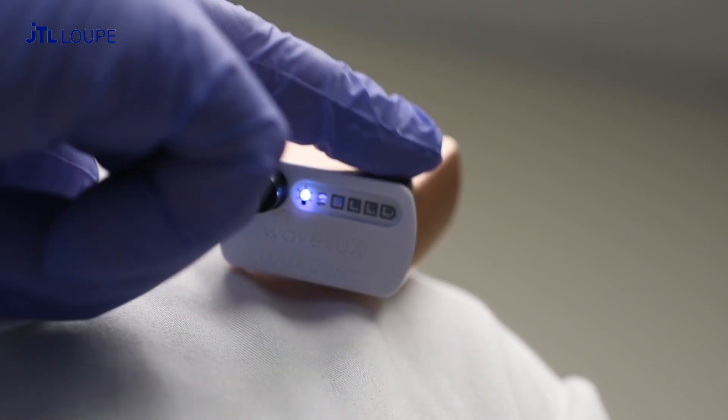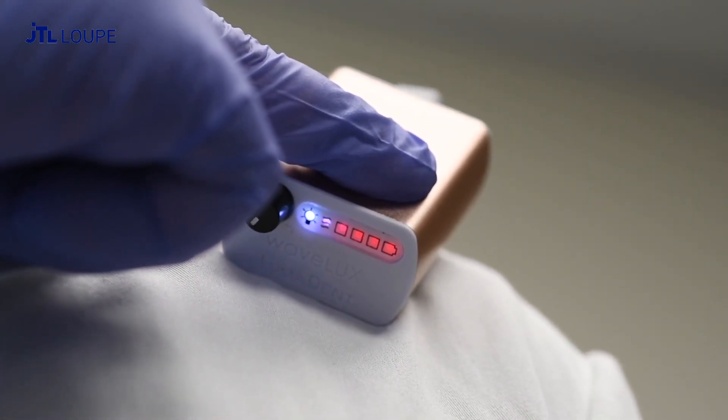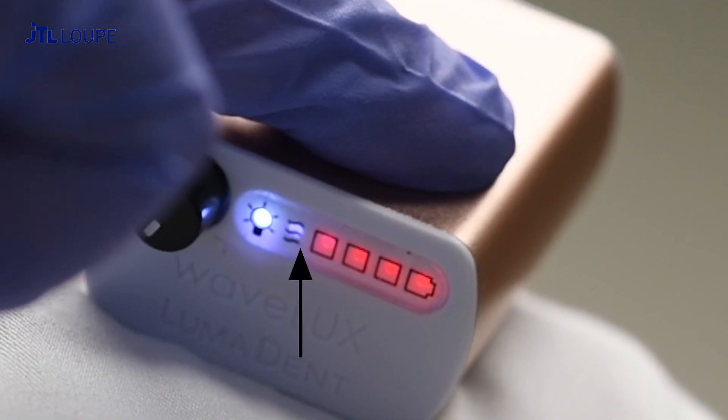To enable or disable the wave function, press and hold the power button for three seconds. The wave sensor light will blink three times when enabled or disabled.